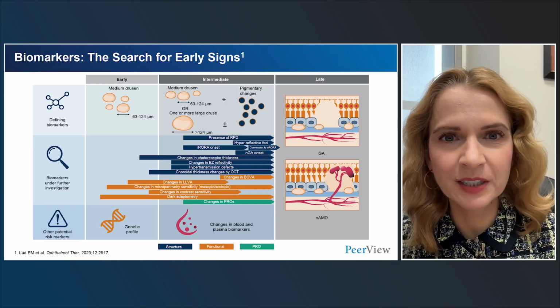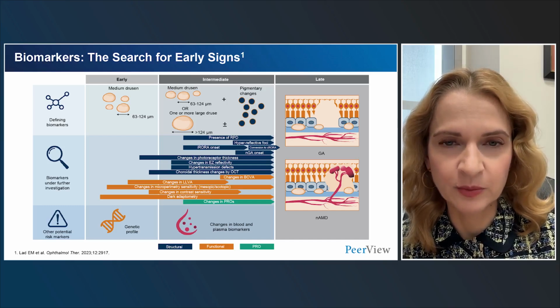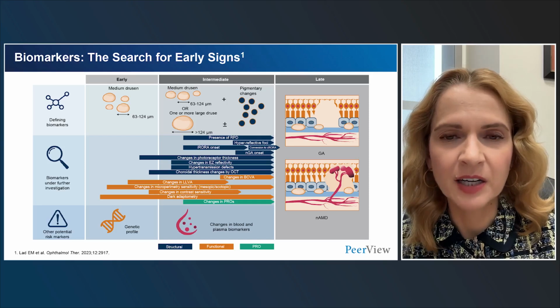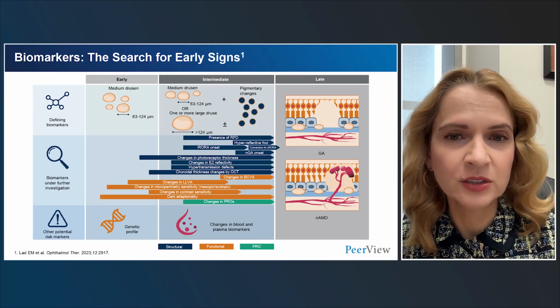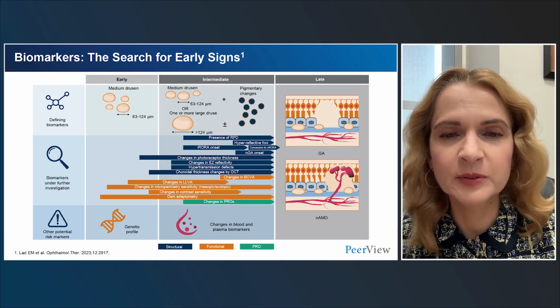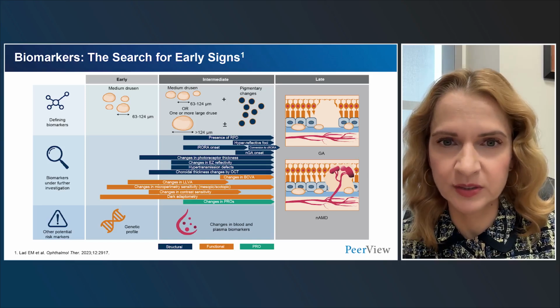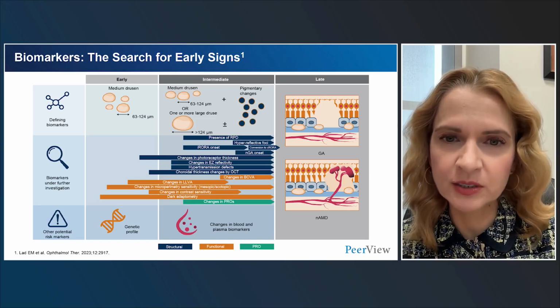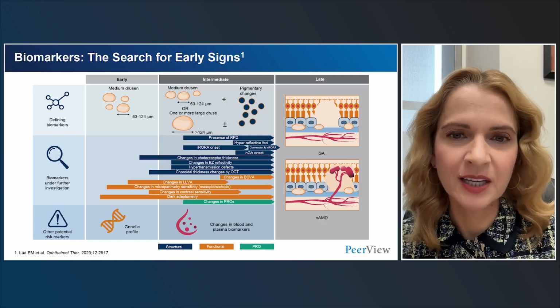In the intermediate stage of the disease, we have a whole umbrella of biomarkers that are valuable. There are reticular pseudodrusen and hyperreflective foci in more advanced intermediate AMD. There's nascent GA onset, changes in photoreceptor thickness, ellipsoid zone reflectivity, which is a layer of mitochondria of photoreceptors on OCT, hypertransmission defects that start to define GA above a certain length, and choroidal thickness changes.